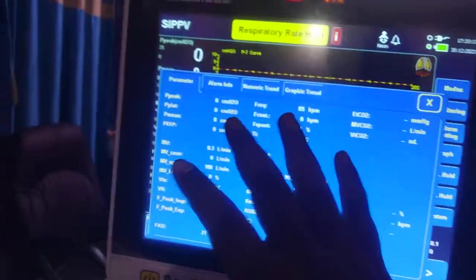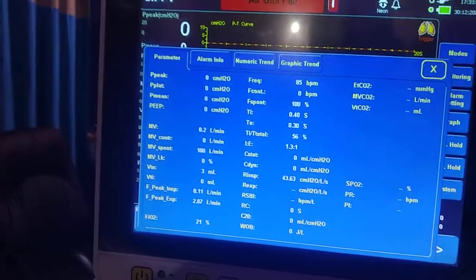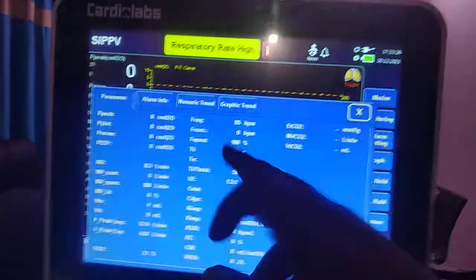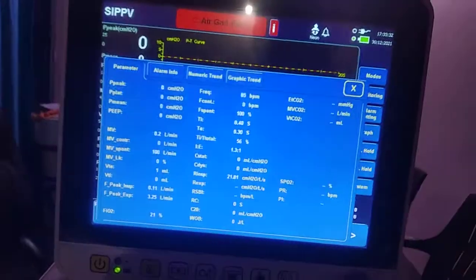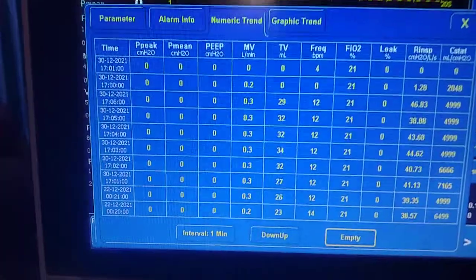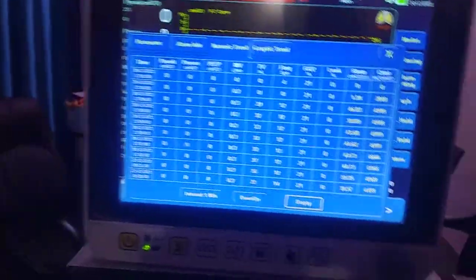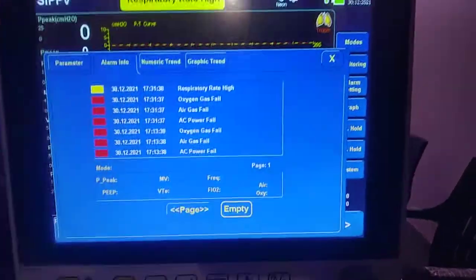In the monitoring window you have access to all parameters to understand the patient's condition — including modern parameters like RC-XP, Work of Breathing, MVspontaneous, and spontaneous frequency. Nothing needs to be purchased separately; everything is built in. From this window you can also access the numeric trend table, which shows the patient's condition over time — whether they are deteriorating or improving.